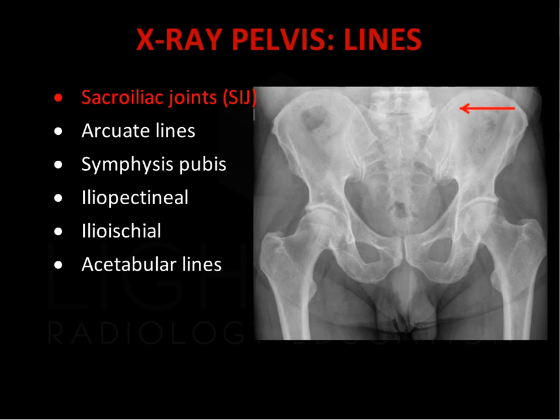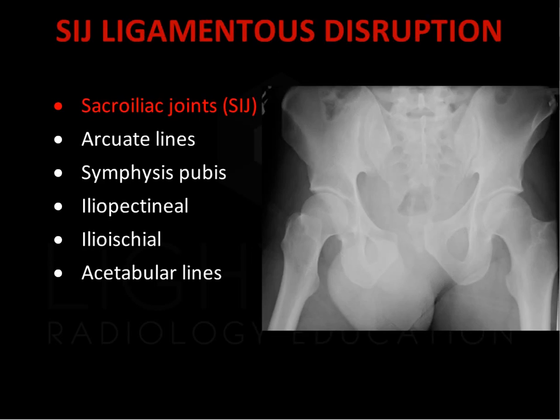Once the rings have been assessed, the pelvic lines need to be assessed. The first of these is the sacroiliac joints. These should have parallel alignment, with the joint space measuring less than 3 mm. Disruption of the sacroiliac joints can occur in trauma involving the main pelvic ring, resulting in diastasis.